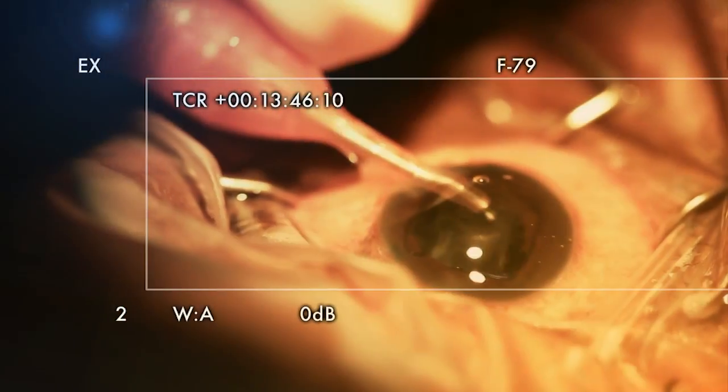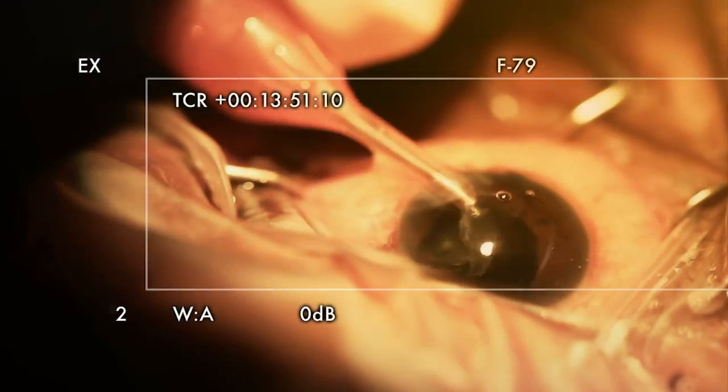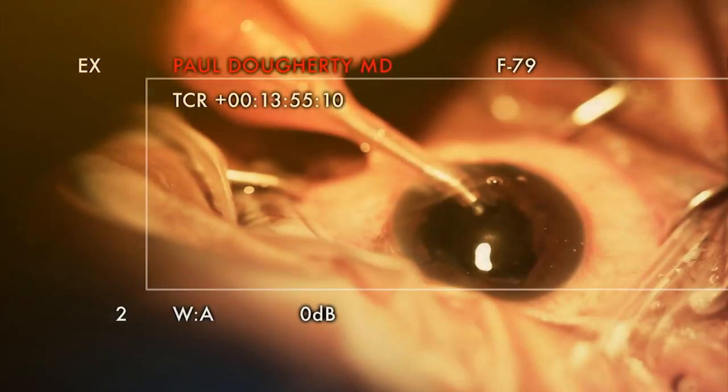Interestingly, these cataracts aren't as dense as the Middle East — they're just a lot more mature, a lot more white. They're just not as dense though.